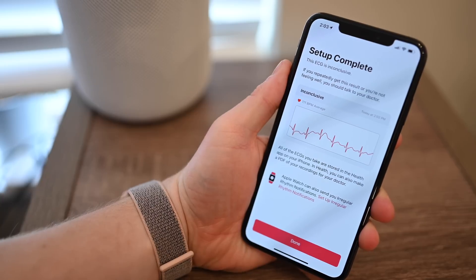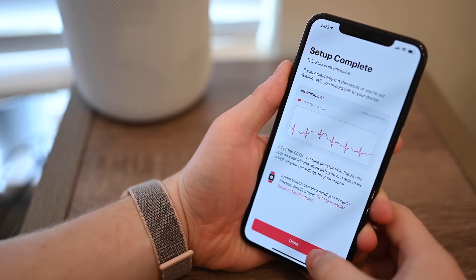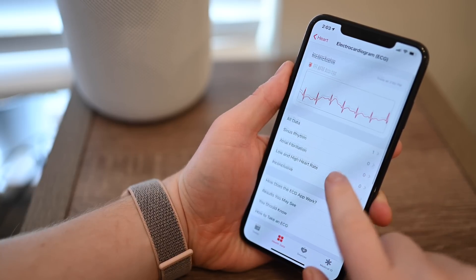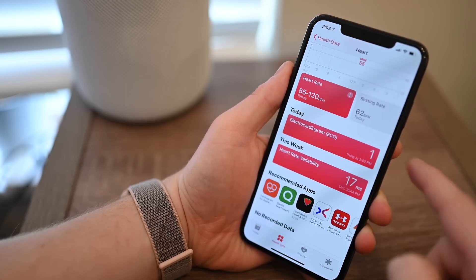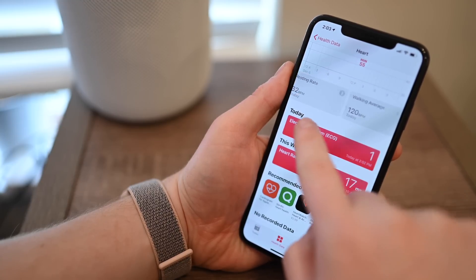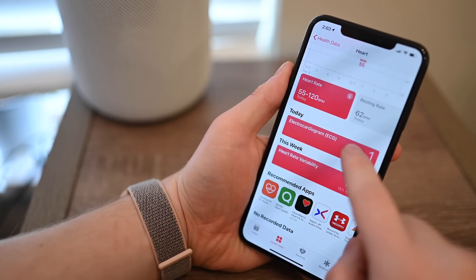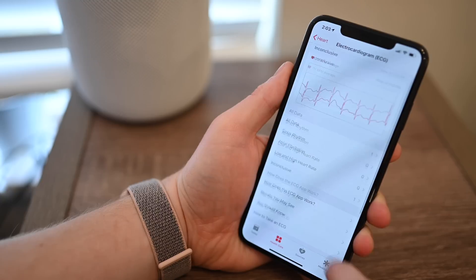Once you've finished the test, you can return to your iPhone — as we are in the middle of the setup process — and it'll give you a rundown of your results. Simply tap Done at the bottom. If you ever want to get back to your heart rate data, open the Health app and go to Heart, and you have that electrocardiogram card right within the Heart section. In there will be all of the readings you take and additional information, including PDFs you can export and send to your doctor.